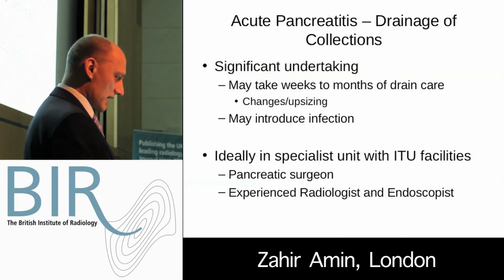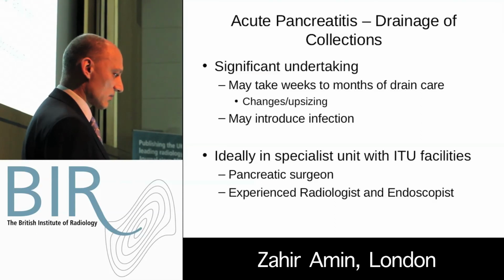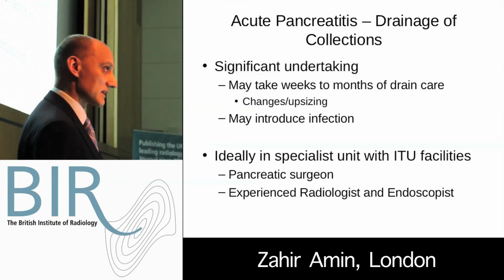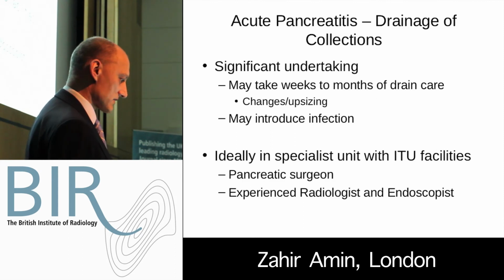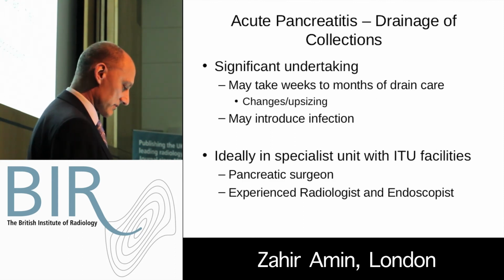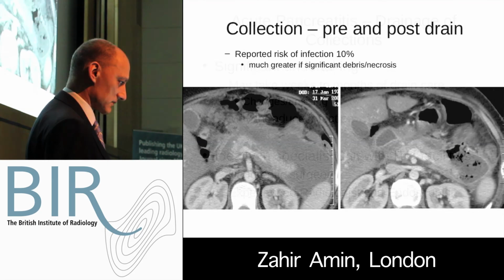So just briefly going on to the drainage of collections. Draining pancreatic collections can be quite a significant undertaking. Patients can be very sick before drainage, or they can get quite sick after a drainage. And it can take many weeks or months of drain care, drain changes and upsizing the drain, and just putting the drain in can introduce infection into a sterile collection. So ideally it should be in some specialist centre with ICU facilities. A patient may end up in ITU. There should be advice of a pancreatic surgeon, and obviously experienced radiologists and endoscopists may be needed as well.